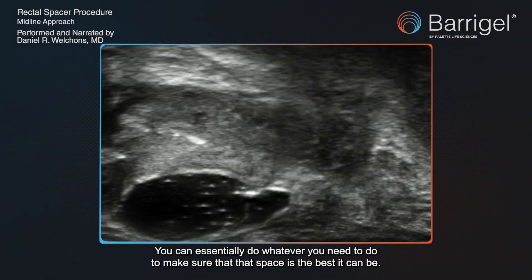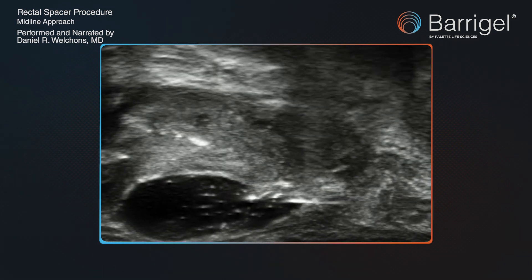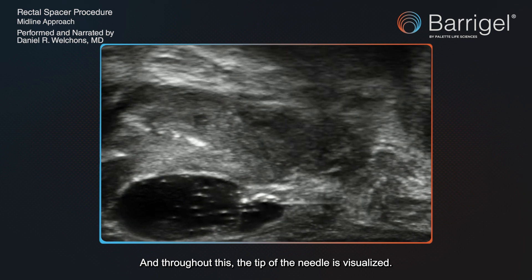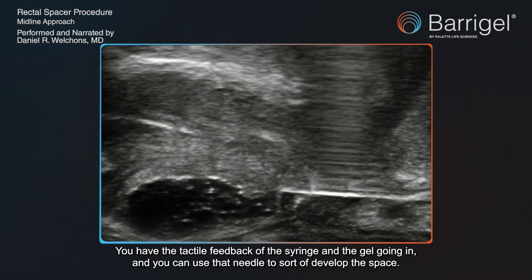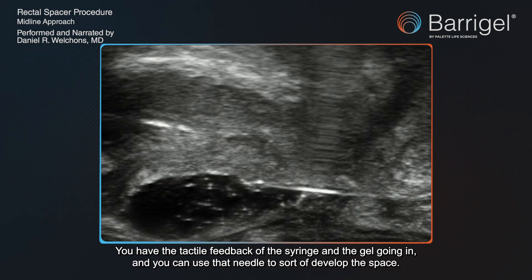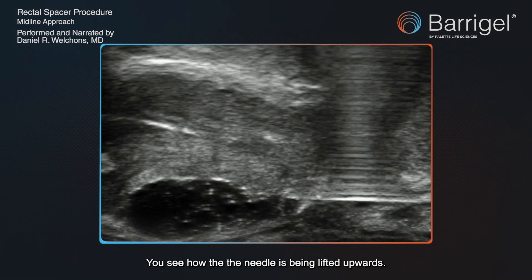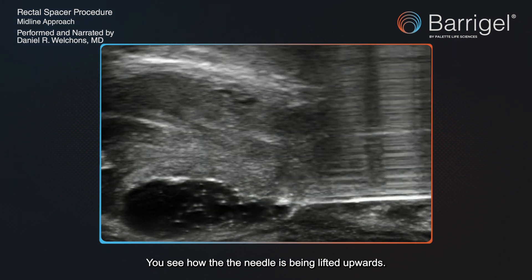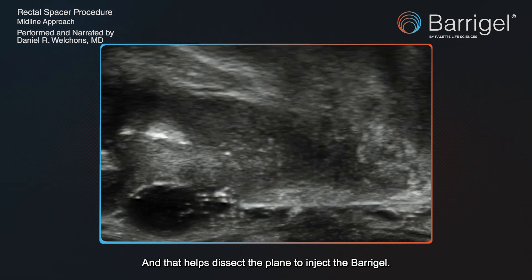You have all the flexibility to do whatever you need to make sure that space is the best it can be. Throughout this, the tip of the needle is visualized — you know you're not injecting into a place you shouldn't. You have the tactile feedback of the syringe and the gel going in, and you can use that needle to develop the space. You can see how the needle is being lifted upwards, and that helps dissect the plane to inject the Baregel.